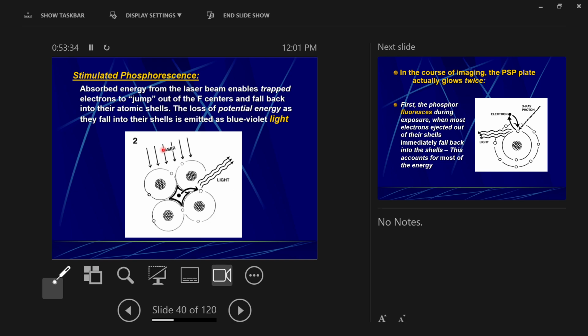Where the book converts kinetic energy, its speed of falling, into sound and heat and stuff like that, this electron will release visible light. So it jumps back into its atom, releasing all of the energy that it had absorbed as visible light.